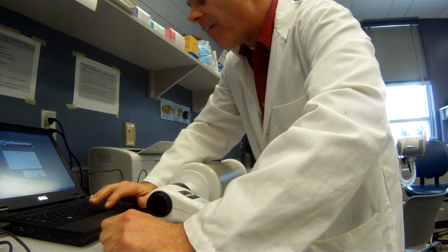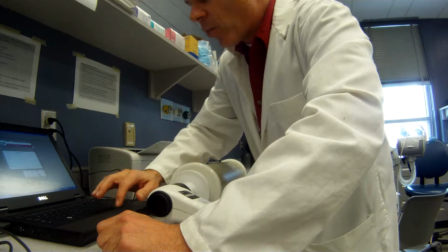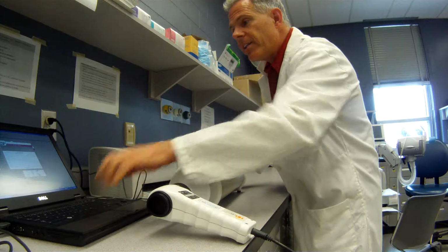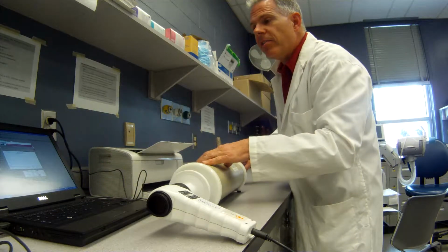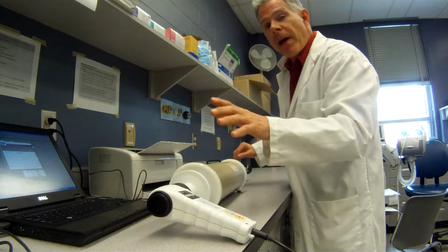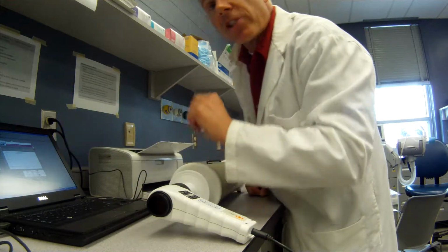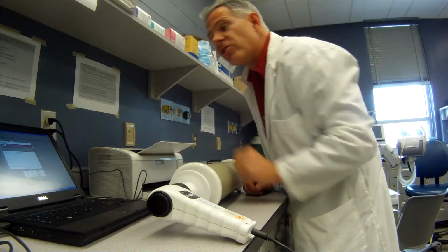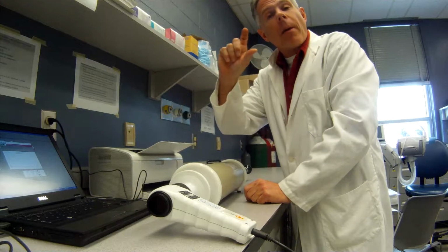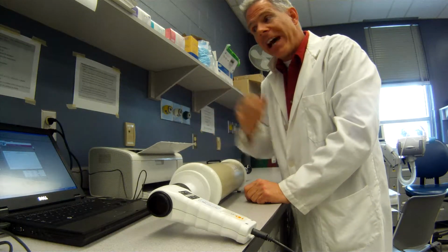So when we click verify and then continue, it starts off with giving us one of those dotted lines. So when we hit the space bar, pull back and meet the dotted line. Make sure we get our low. All right, comes back now and says, okay, that's good. And it shows us the volume. You can actually read it off, and it says it's 3.02. And that's good because that meets our plus or minus 3% of our 3 liter syringe, which is 90 mils.